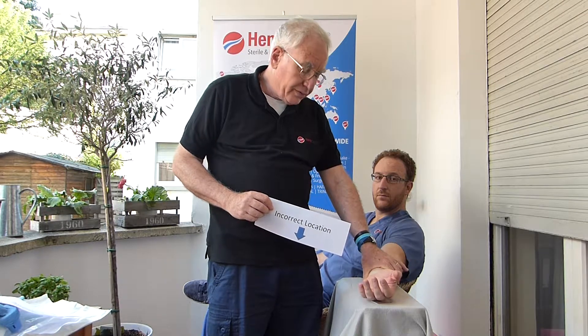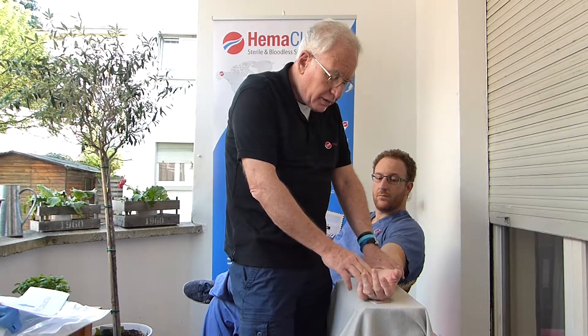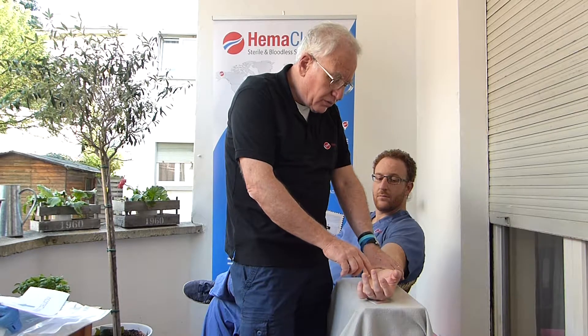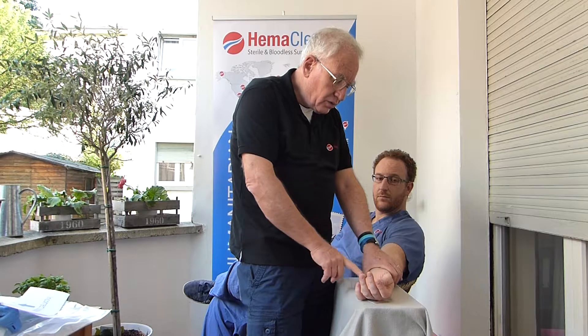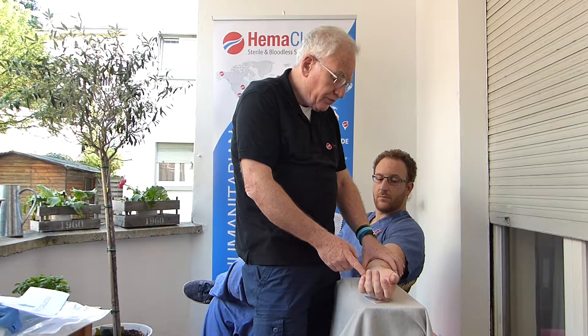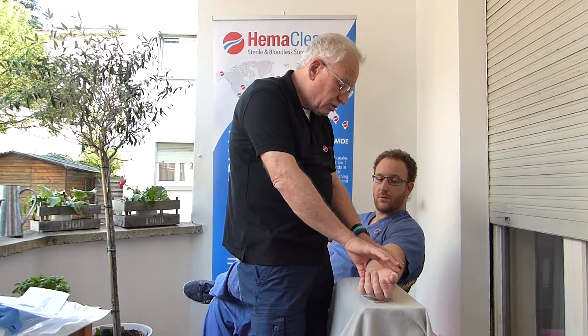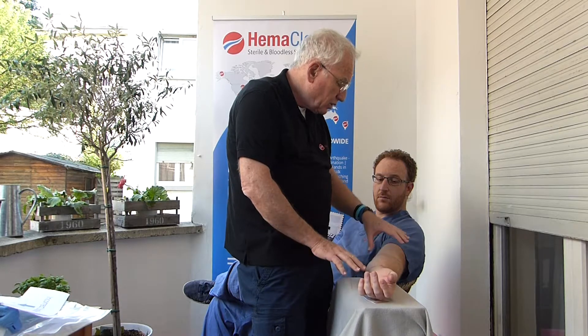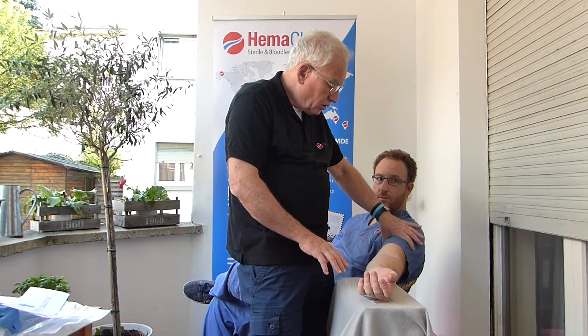This is why we ask that the Hemaclear be placed at the correct location, which is a good position for doing all cases involving fingers, hand, and carpal tunnel, whether above or below the crease. But if you need to operate on the distal radius, the distal ulna, or anywhere above the wrist, we recommend placing a Hemaclear — either medium or large — in the upper arm.